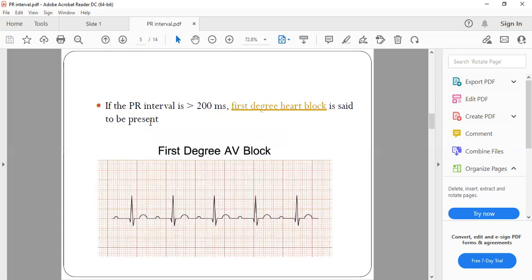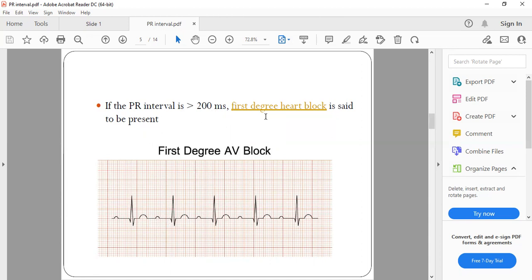If the PR interval is more than 200 milliseconds, that means there is a longer time being taken for the atrial depolarization to pass on to the ventricles, indicating an AV node delay, which is characteristic of first degree heart block. The PR interval should be less than 5 small squares. Here you can see roughly 7 to 8 small squares, which is why this PR interval is more than 200 milliseconds — characteristic of first degree heart block.